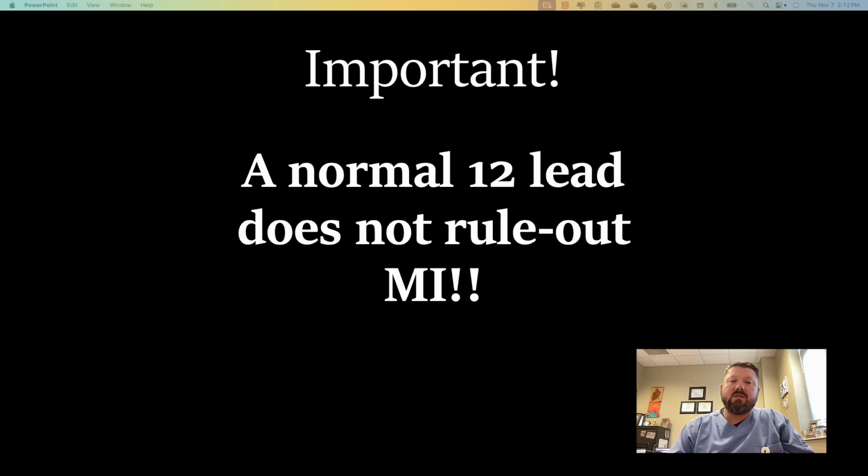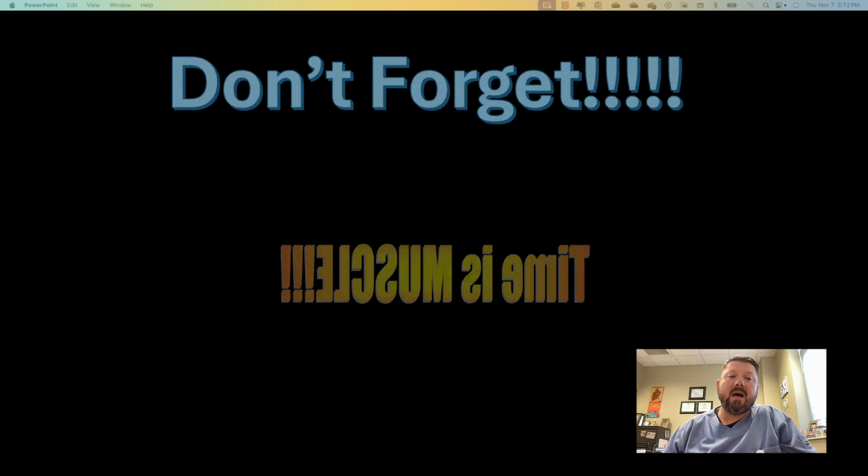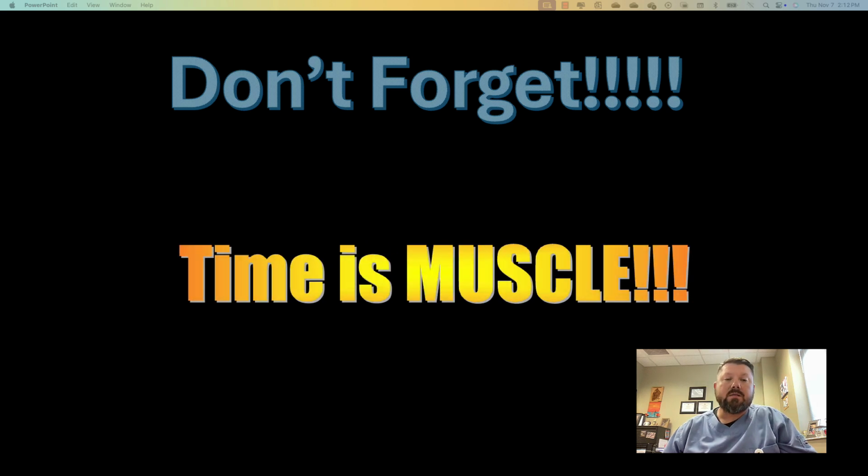About 10% of patients with a proved acute MI, which includes a clinical history and those enzymatic markers such as your troponins or your CKMB, failed to develop ST segment elevation or depression. But don't forget, time is muscle.